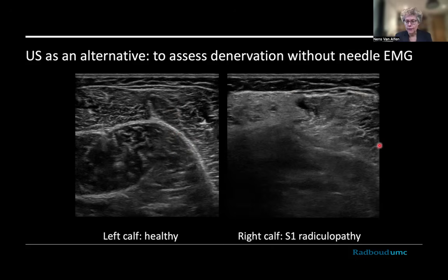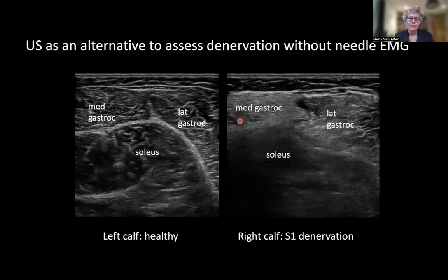And then we scanned the other side, and you can see that now the medial gastroc, which is on this side, is very abnormal. Lateral gastroc is also not okay, but not as fibrotic as this one. So something's going on in this calf. Okay, it's the symptomatic side. And it's more in the S1, S2 component than in L5, S1. So you know that this is confirmatory of a specific type of pathology, right? And then if they allow you to stick a needle in, you just stick that in one muscle and not just blindly assess them all. And so here's the corresponding anatomy for this slide.